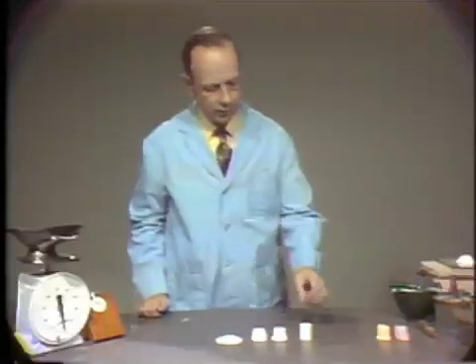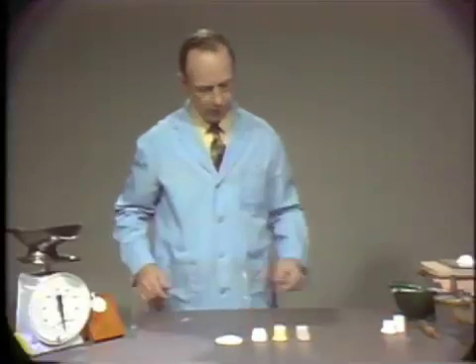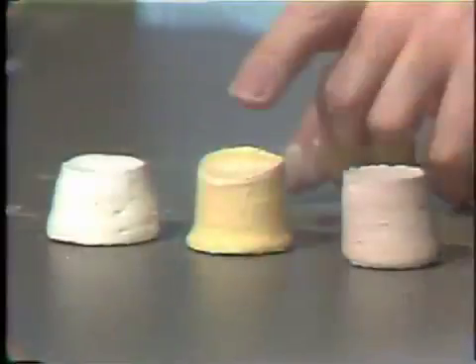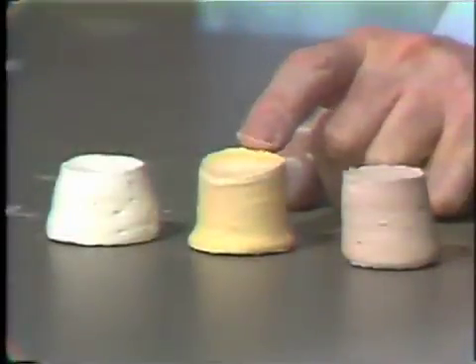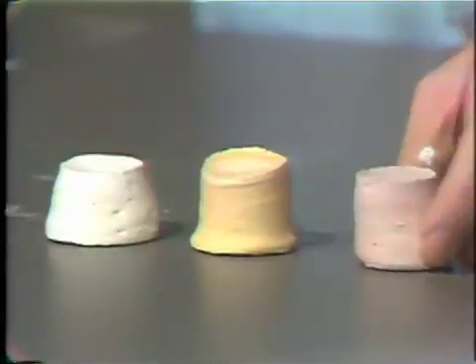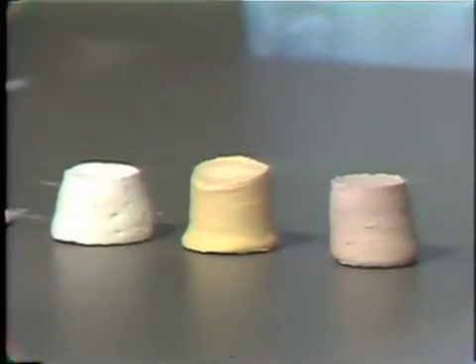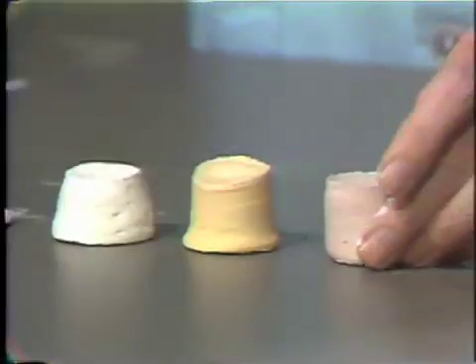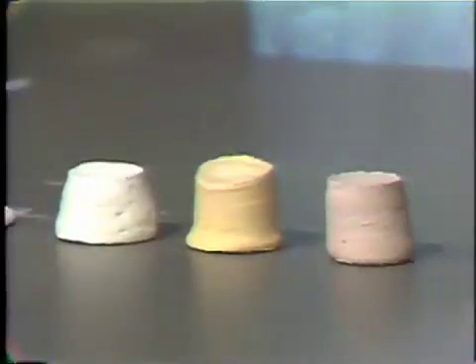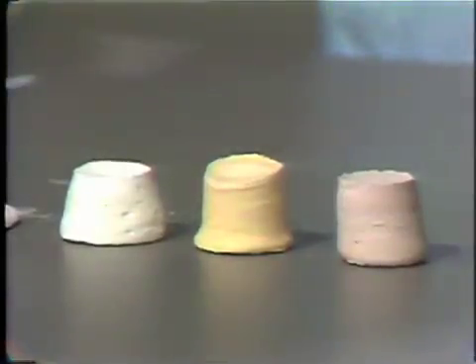Now I'd like to show you two other samples of products that are similar to model plaster. This yellow material is regular dental stone — it can come in several colors, but a common color is yellow — and improved dental stone, which may come in shades of green or pink, as this particular material is. These are essentially the same chemical as model plaster; however, they've been manufactured in a different way so that the powder particles are much more regular and much larger in shape.